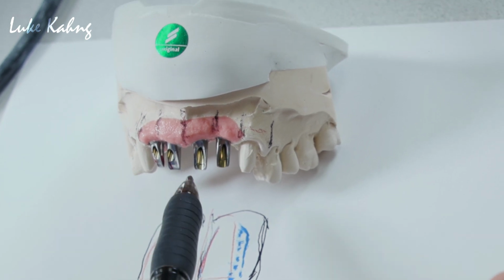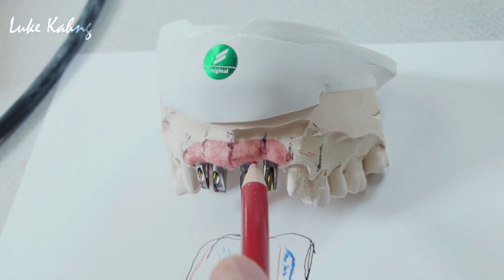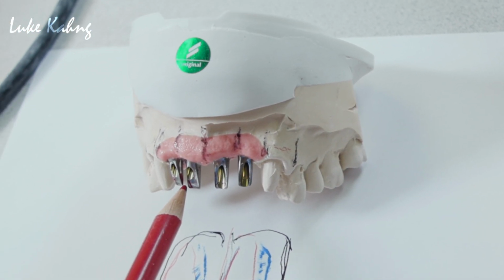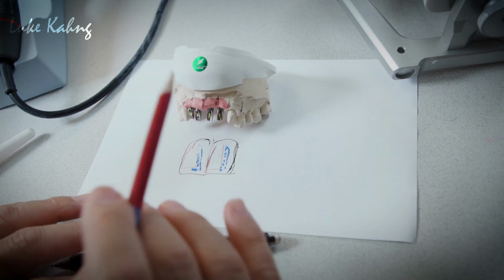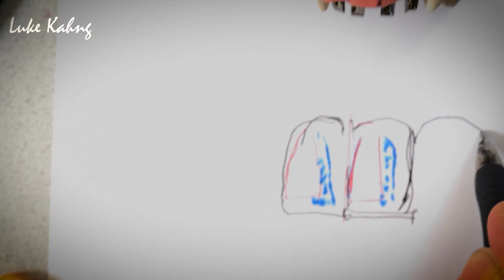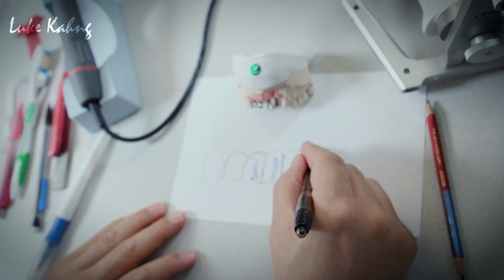They set up the final tooth, it's not as serious as they think. So we have to take the final contour considerably, and then I can move that area, and this area, like here, I have to move more. This is too tall, cut it. And same thing here, especially here is a big problem. They have to weld it here, and then cut it, eliminate it. So, like I said, number one, you can go to 6-unit design. All the time you have to draw or you have to design with whatever library you have. Okay, you have to design the final contour.